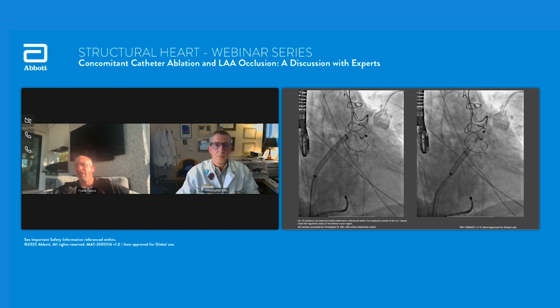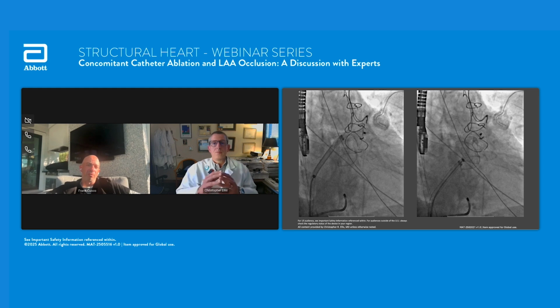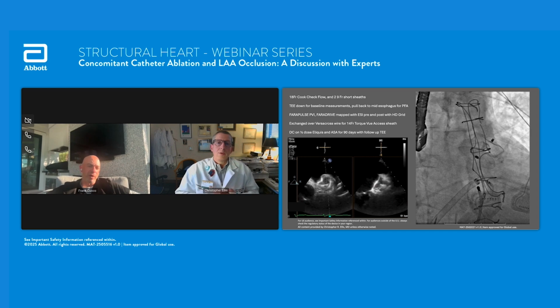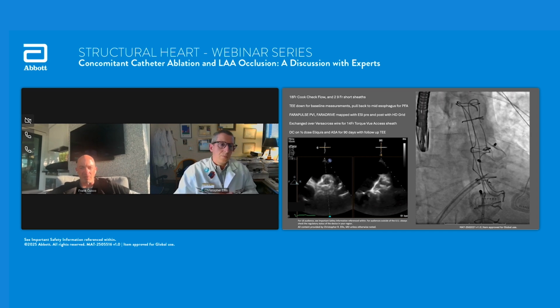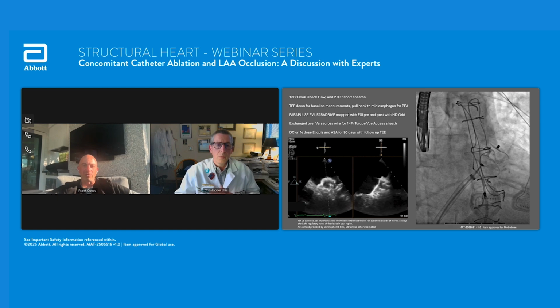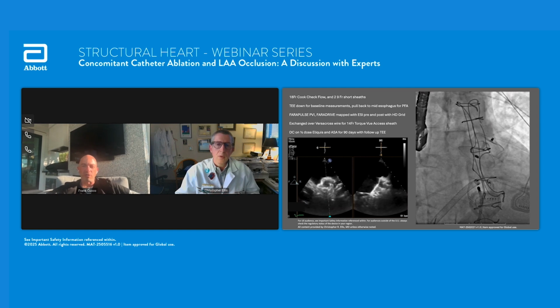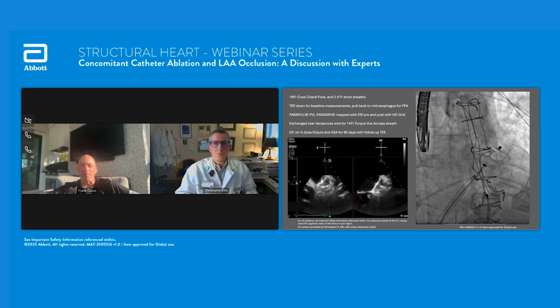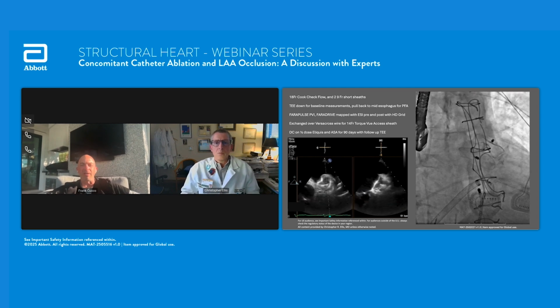And even if they're in AFib, I don't really have a problem doing the CTI first because I'll check for block afterwards on the way out. And with the techniques we have, and as you know, I'll be showing this in a live case next week at the PFA symposium, getting block with PFA catheters in the CTI is not challenging. It's very straightforward, and the block is almost always achieved with first pass and durably. So I'm willing to do that first, and if they're in AFib and I can't check for block before I go over to the left atrium, I'll check for block after they're in sinus rhythm.